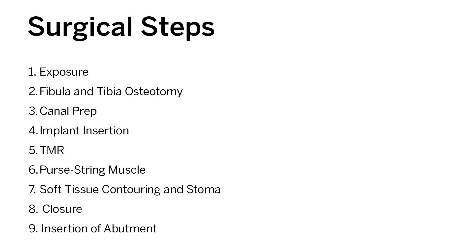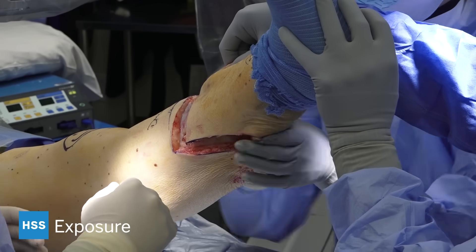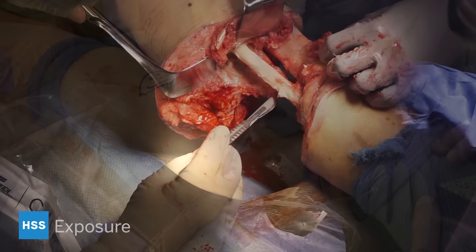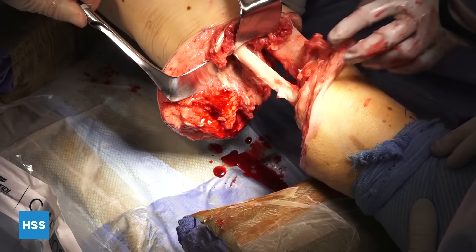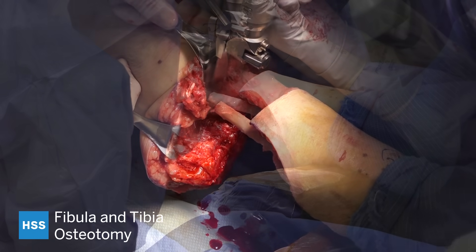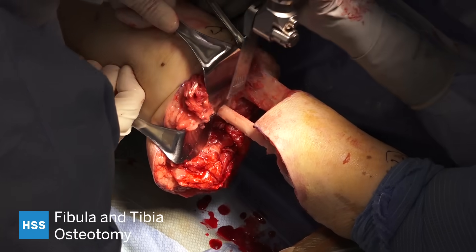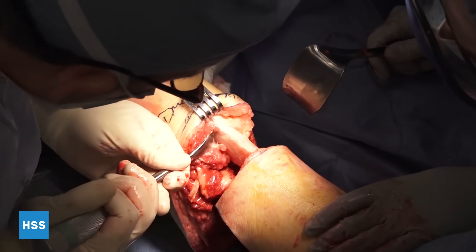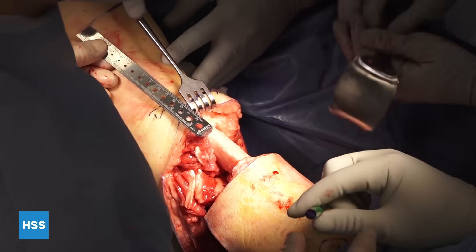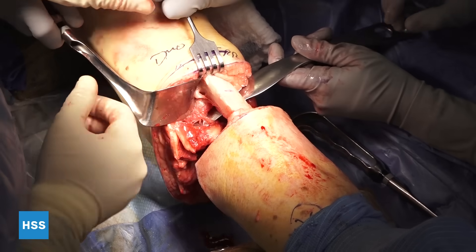The surgical steps are going to be outlined in this video. This is the exposure for the initial amputation — you can see we've got anterior and posterior flaps exposing the fibula. The fibula osteotomy is done about 2 cm proximal to the tibial osteotomy. Soft tissue is cleared and the osteotomy is done with a saw while cooled with saline. This part of the surgery is done with the use of a tourniquet.